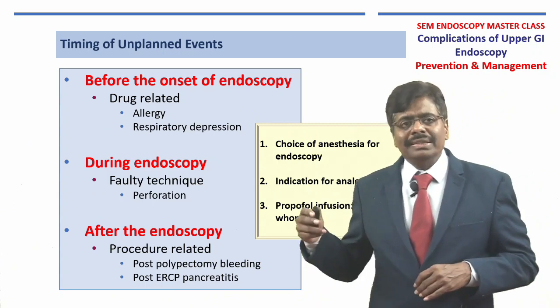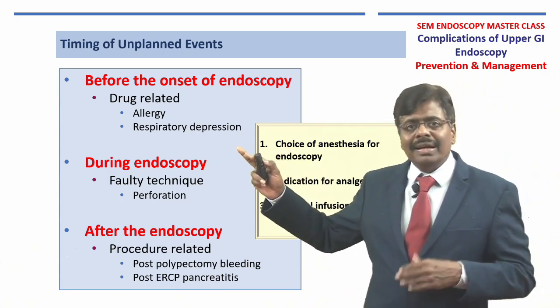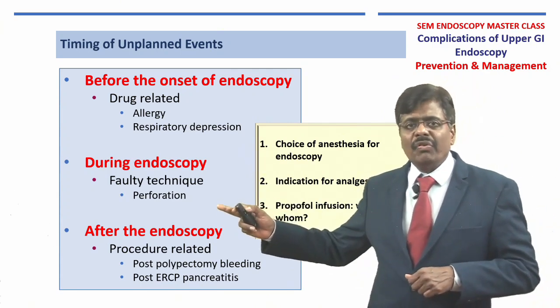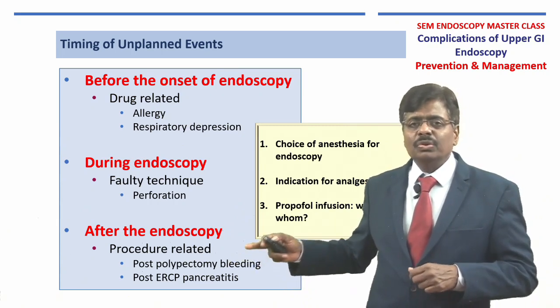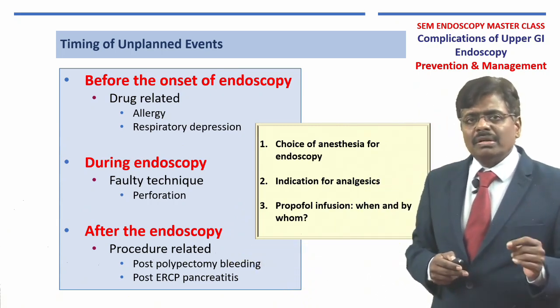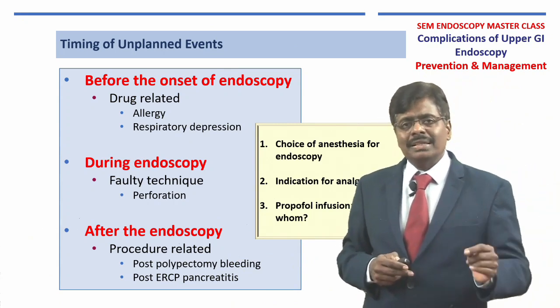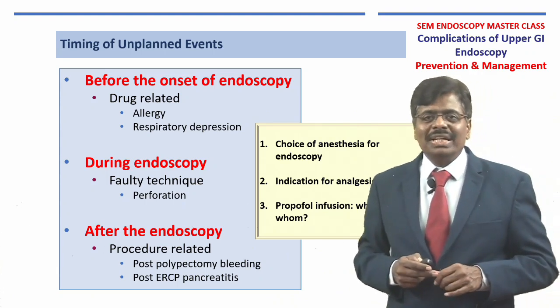Coming to the timing of the event, sometimes even before endoscopy, during the drug injection, the patient gets into trouble, or during endoscopy because of your faulty technique, or soon after the procedure. So, it is always very important to anticipate. For example, in every patient after ERCP, you anticipate the possibility of post-ERCP pancreatitis.